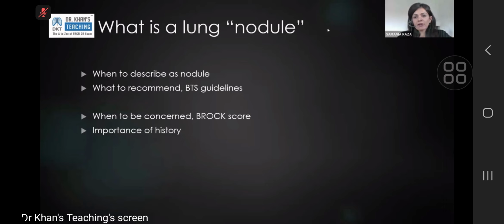What that means is all of the lesion is not solid. A lesion can have solid components. This lesion is still classified as a subsolid lesion because subsolid by definition means at least part of the lesion is not solid. By not solid, they can be ground glass, they can even be cavitating. So yes, solid and subsolid.